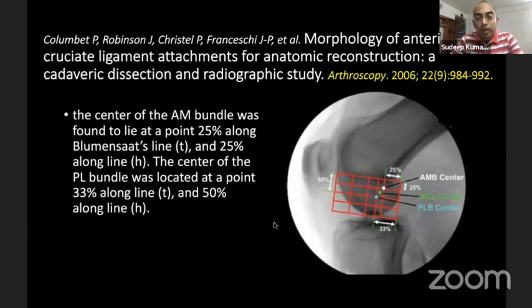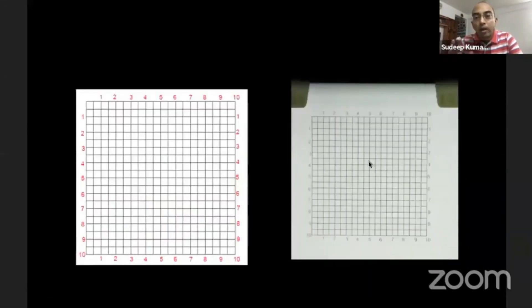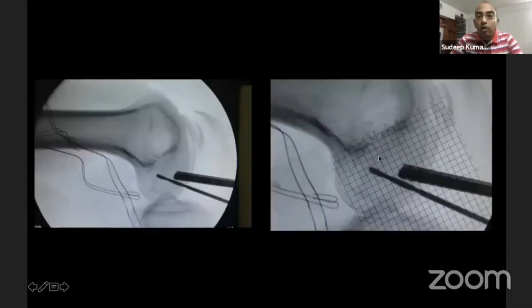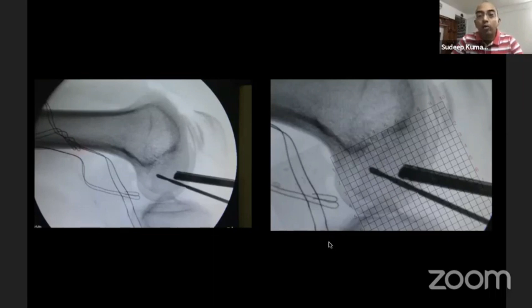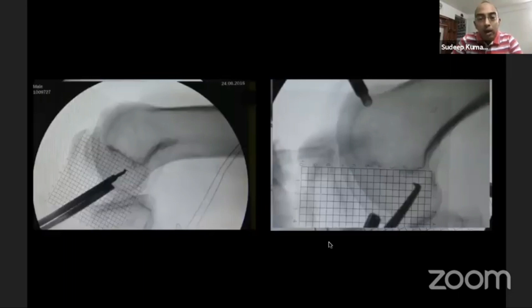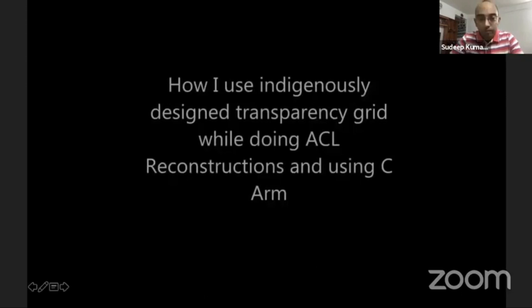What we did was print equidistant boxes on an old-fashioned transparency sheet — the kind used for presentations. We use this sheet along with the C-arm while making our tunnel. A shot is taken, the transparency sheet is laid over it, and the surgeon is told whether to go back or forward, up or down, and can make adjustments for both femoral and tibial tunnels.